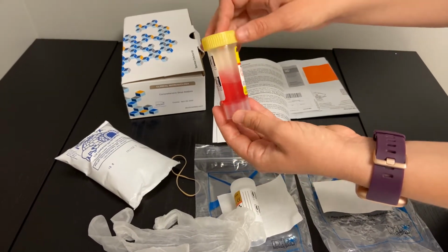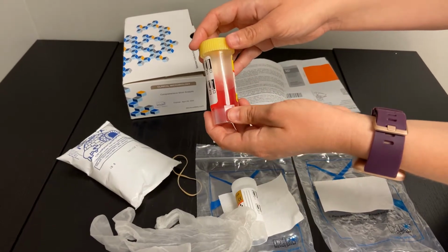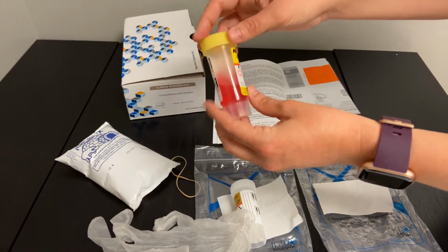So with this vial here, you'll see when you have it with you, it might be difficult to see on the video here. There is a little bit of a spatula spoon type situation that's attached to the top of this vial, or the top of this lid rather.